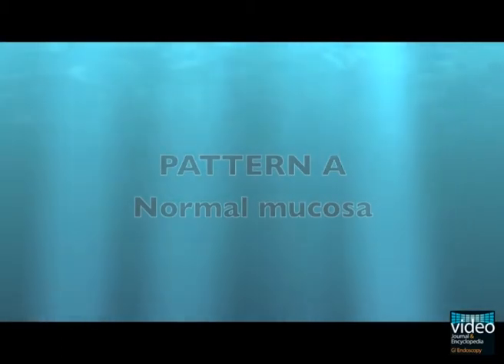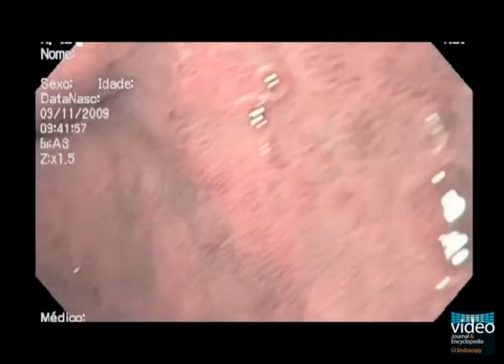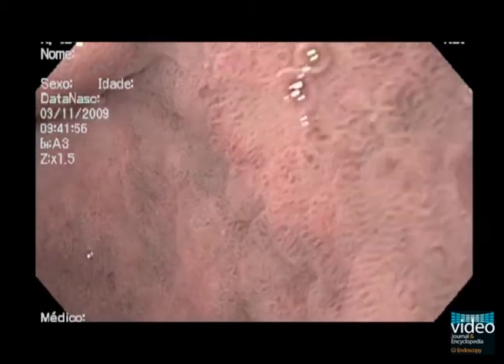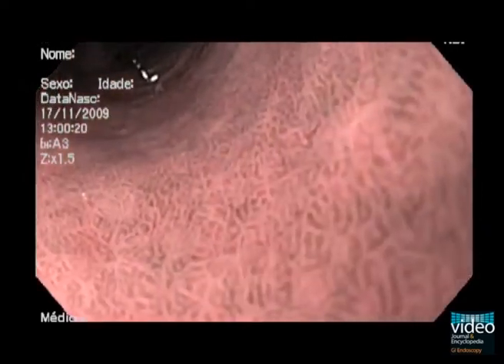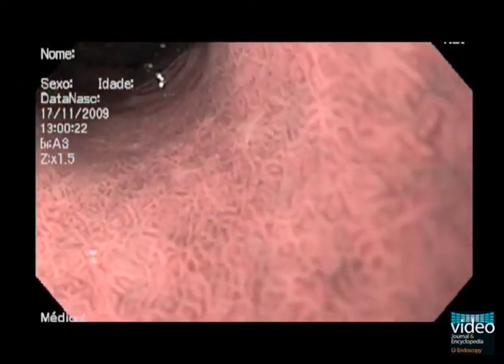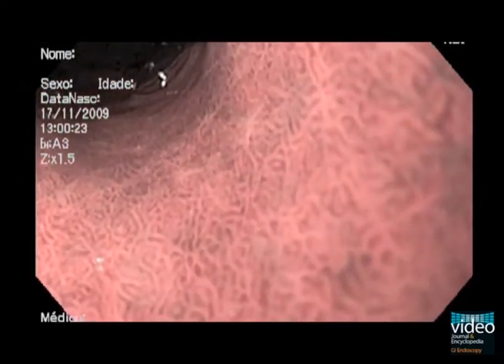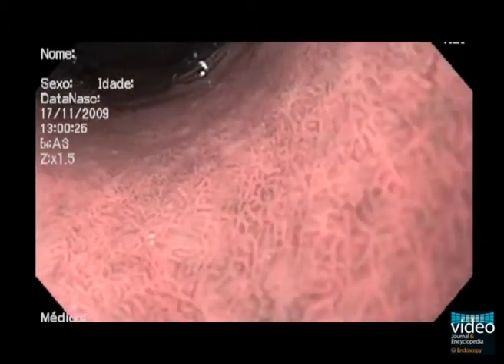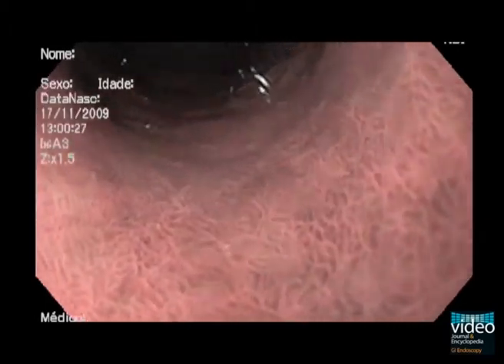Normal antrum mucosa shows regular circular oval mucosa surrounding regular thick vessels in the centre of the gland. In the transition area of corpus, antrum and angulus, the patterns become thick vessels surrounding circular mucosa in the centre.